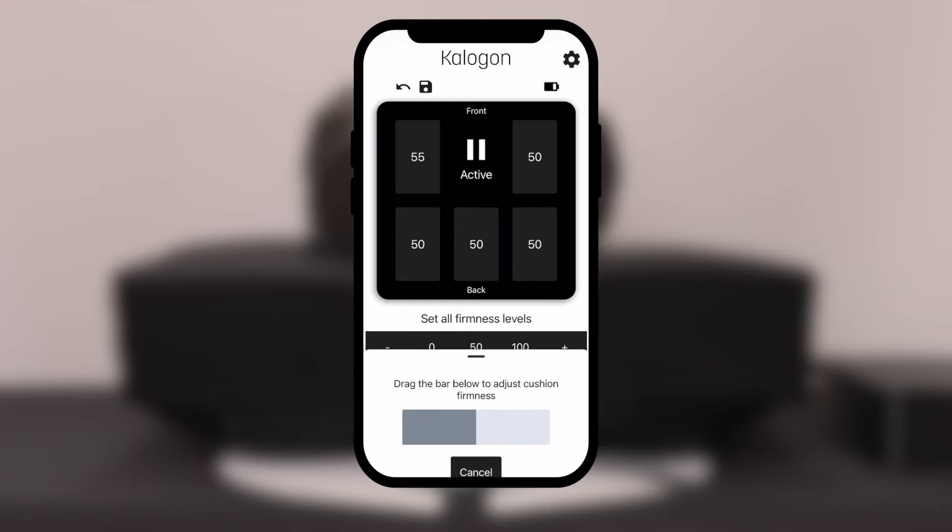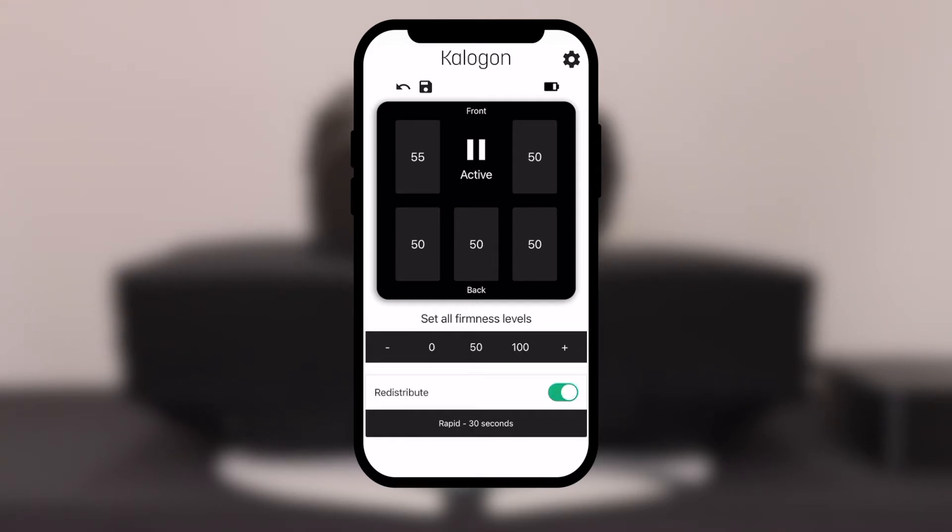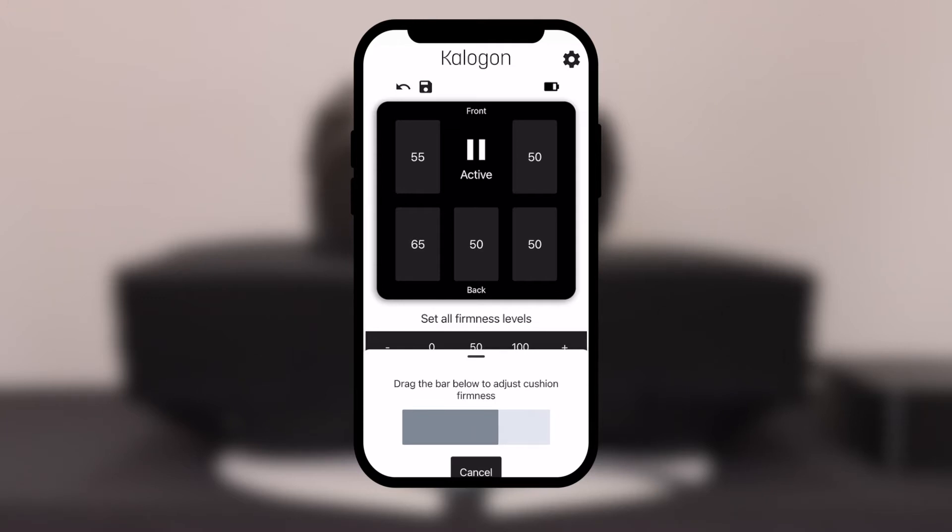Through the Kalogon app you are able to customize the cushion to your precise needs by selecting the firmness levels in one area while still providing pressure redistribution in the other areas.